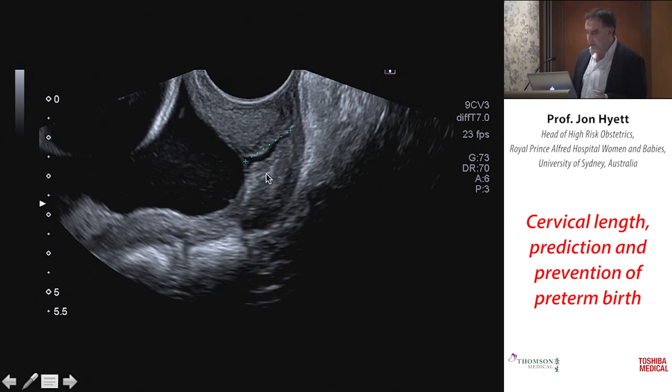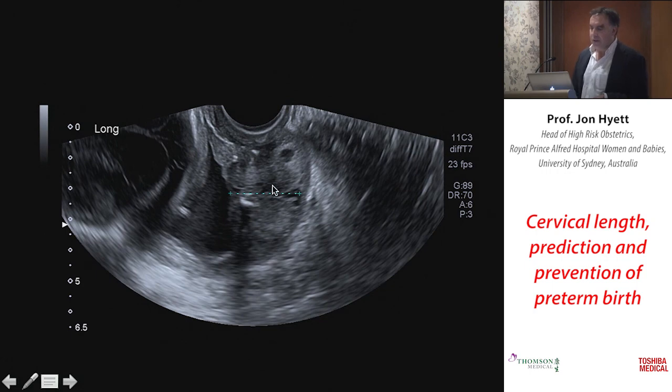The cervix is about 12 millimeters long here. And so we actually then put a stitch in at this point. You can see the stitch here, and we have a slight increase in cervical length up to about 15 millimeters. In our group, only about 4 of us put most of the stitches in. This is instant feedback on your surgical ability. So you can see, in fact, I'm not very happy about the fact that this stitch is so close to the cervical canal. I would have preferred that component to have been further down in the posterior lip. But it does actually help me as an individual. It's quite painful in terms of self-reflection, but it does, I think, help improve my performance gradually.